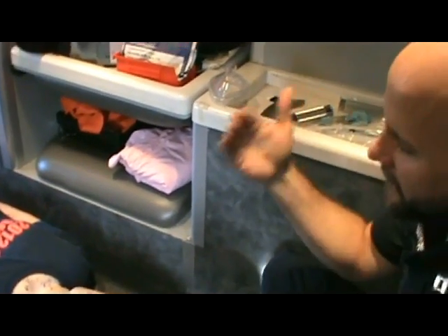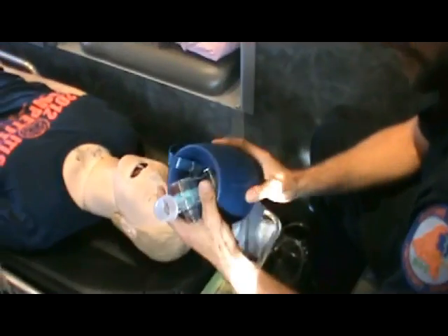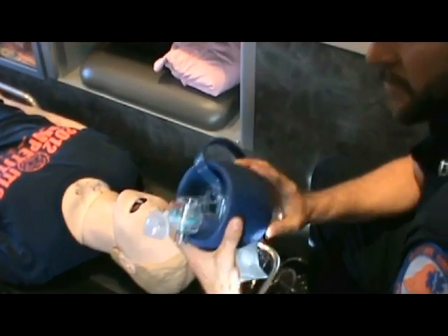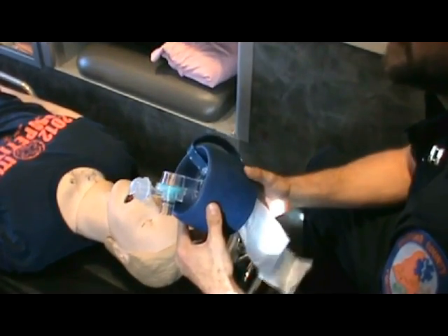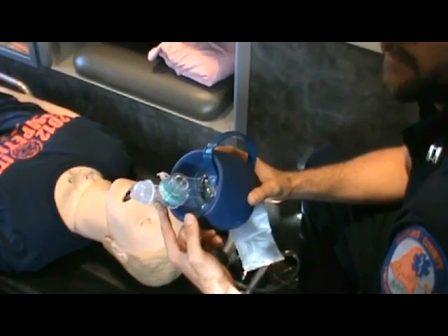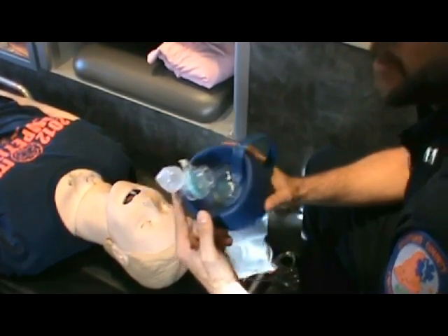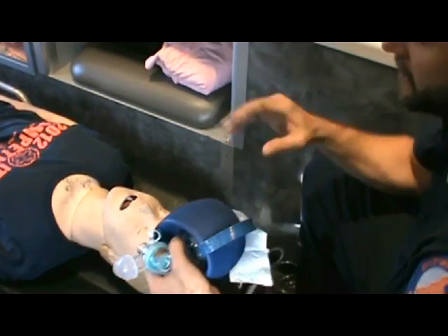First and foremost, before we get into the intubation part itself, let's go over the bag. I know that this is old hat for a lot of you, but it's always good as a review. We talk about the BVM — there's an anesthesiologist who is quoted: 'I can teach you how to bag in five minutes, but it'll take you five years to master.' And I truly believe that.